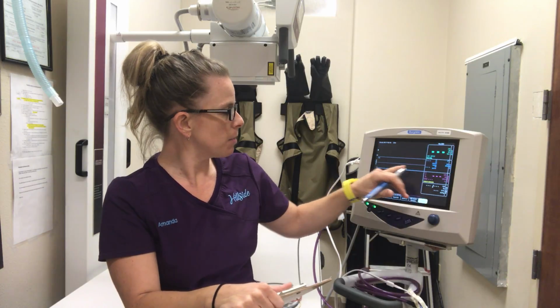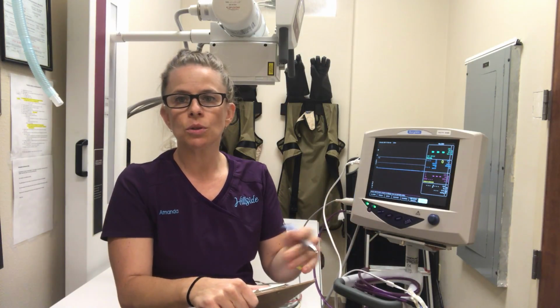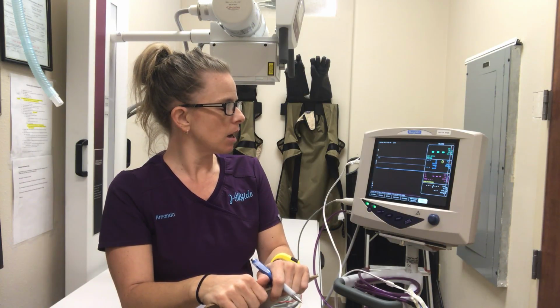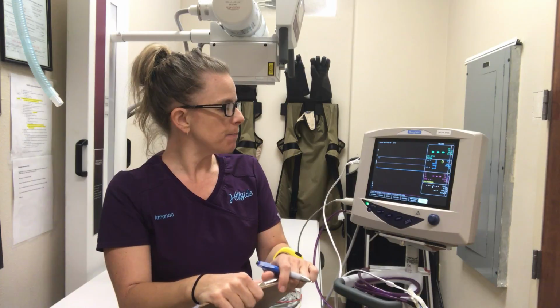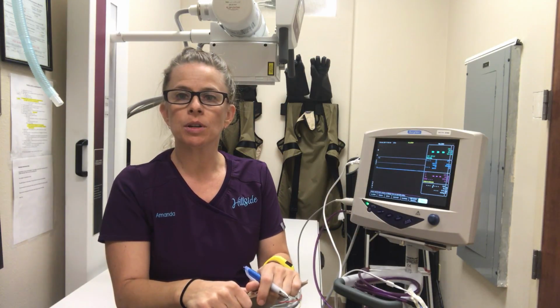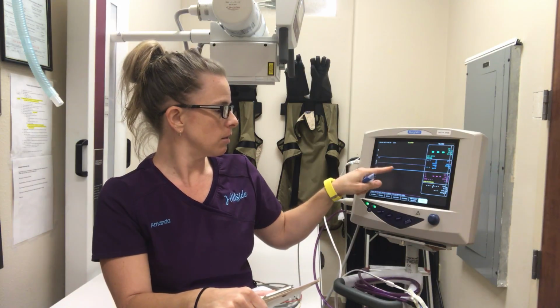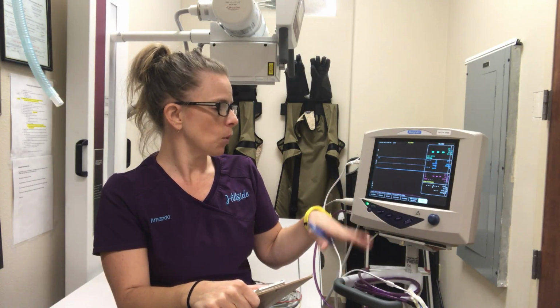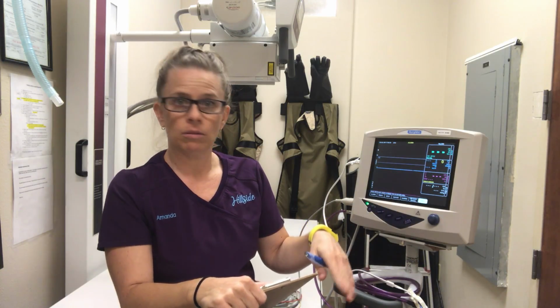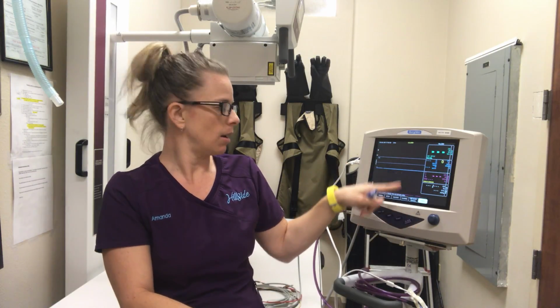Definitely, this monitor also monitors the patient's CO2, so how much carbon dioxide this patient is exhaling. And then in this same section, it does record the respiration rate, so you know what's happening, and it gives a nice waveform going down when the patient breathes in, and then when it's exhaling the carbon dioxide, it humps up.